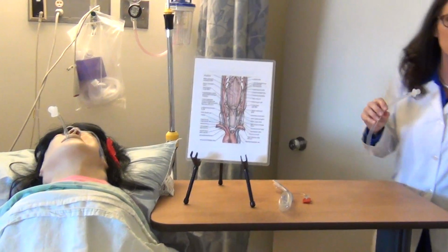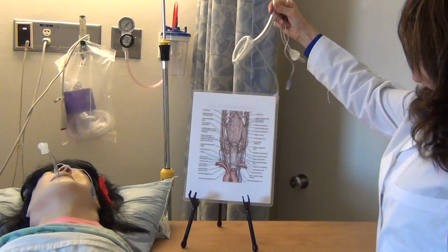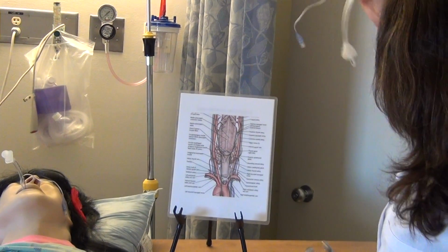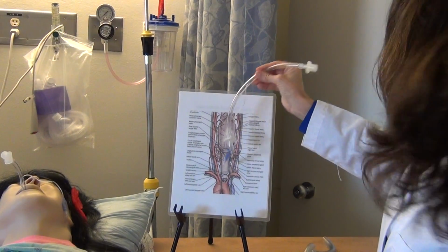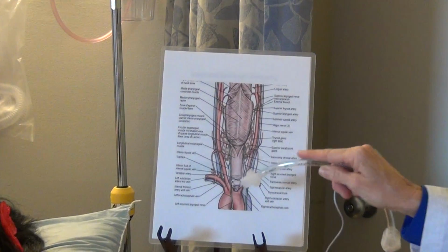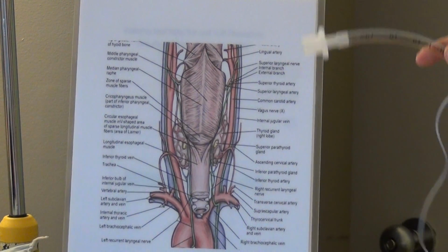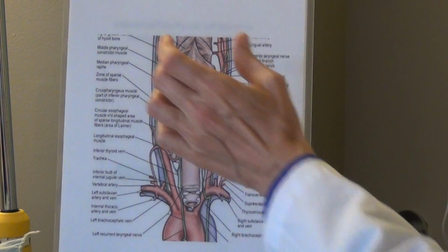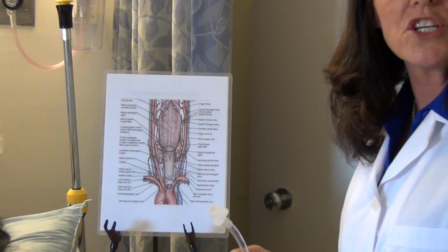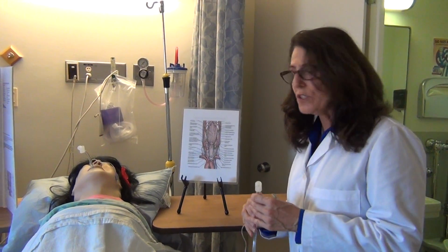Now, with an LMA, laryngeal mask airway, even that should have the cuff pressure checked, because this is an LMA right here, and that's going to sit up higher. An endotracheal tube is going to sit lower. But what you can see, the green is the recurrent laryngeal nerve that sits in the tracheoesophageal groove. The red is the blood supply. You can see how the blood supply and the recurrent laryngeal nerves are vulnerable to compression and injury, and we don't want to have any harm done to our patients during surgery.